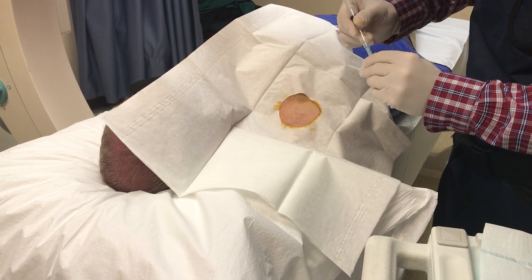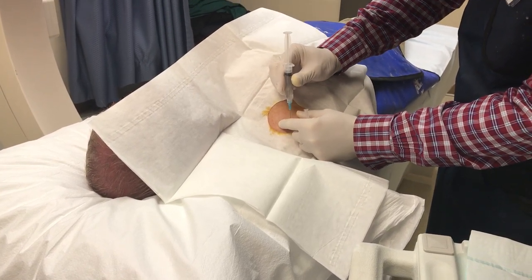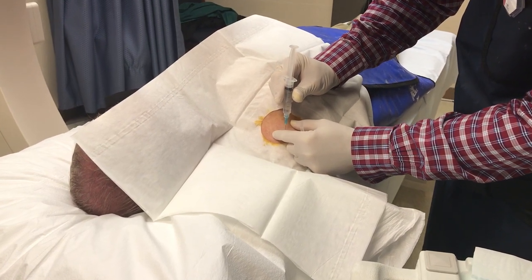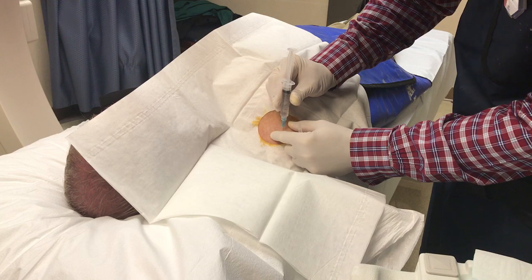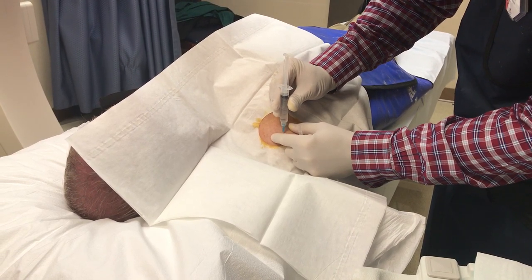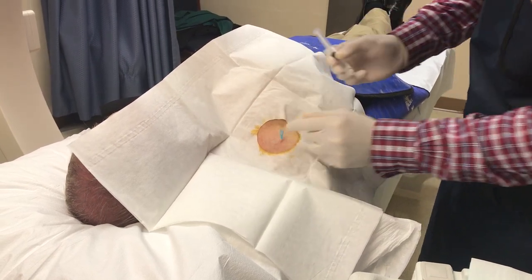We'll go in with a little pinch on three — one, two, three, and pinch. I'll go down really slowly, making sure I don't plunge into the bone. And I can feel myself go through the capsule. Then we'll un-needle and take an X-ray.